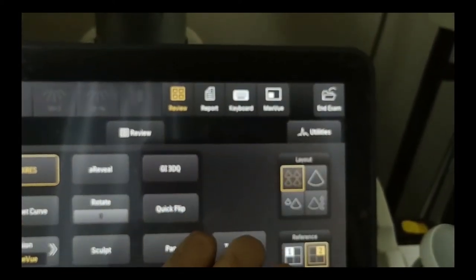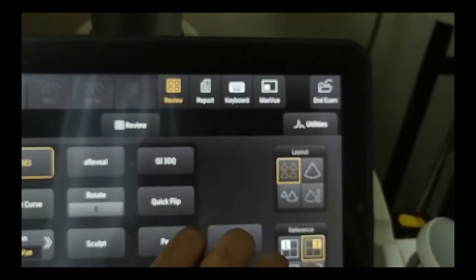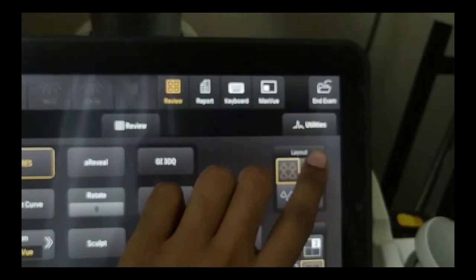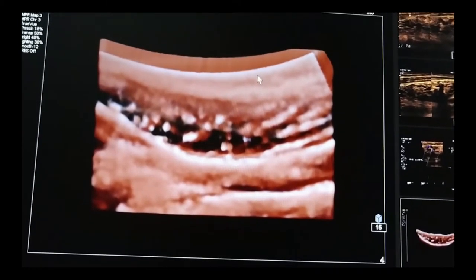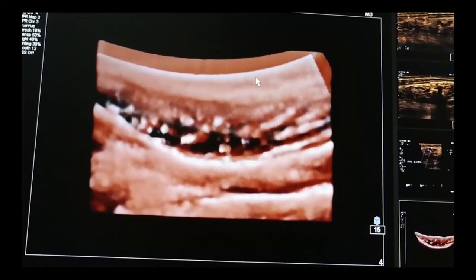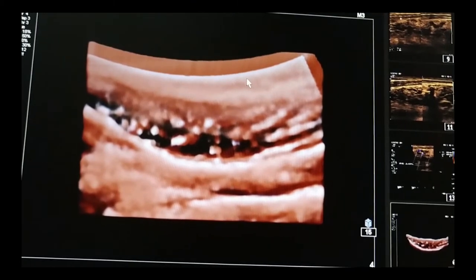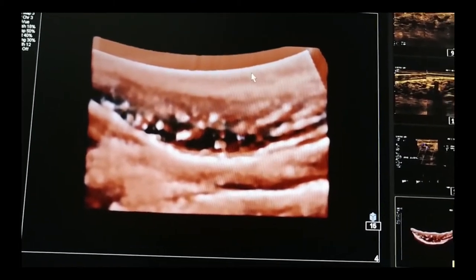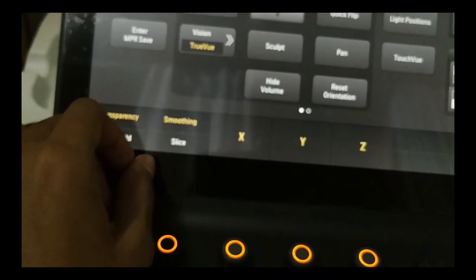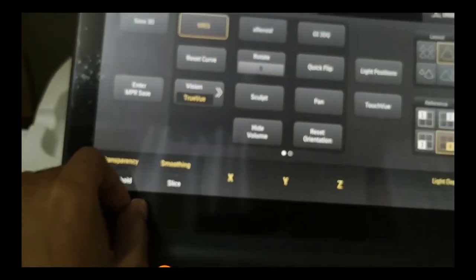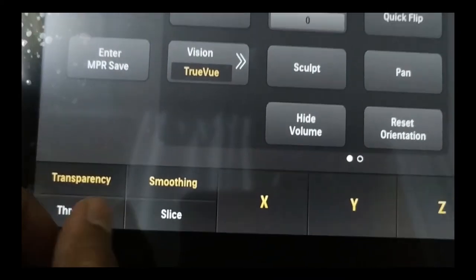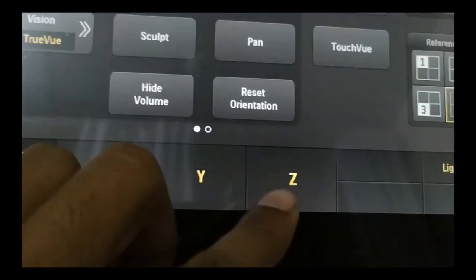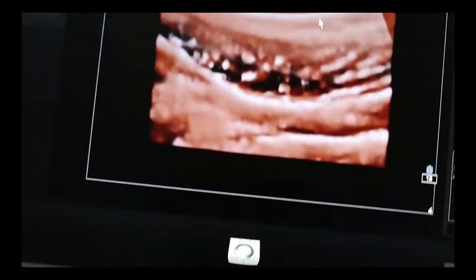Now I am choosing the fourth image, that is the 3D image, and opening it on a single screen from the touch panel. Now I need some editing. I will use smoothing, transparency, threshold, and slice options to make the image beautiful.